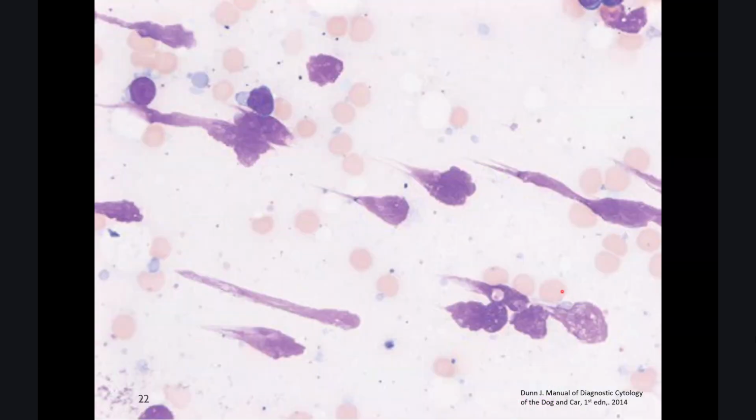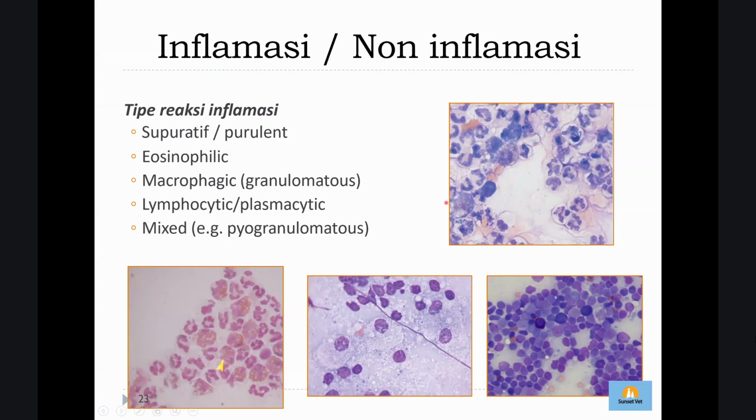And this is the thing that you're gonna hate, because this is the round cell, this is the nucleus, and you don't see any cytoplasm. Why? Because you squashed it too strong. So you don't need to squash it too strong, you need to take good care of your sample, unless you're gonna see something like this one. This is typically lysed cells.